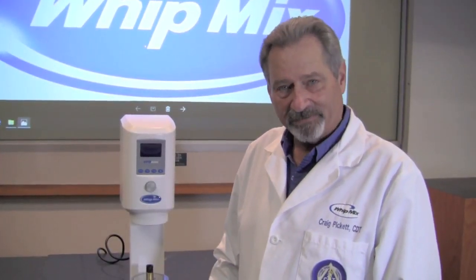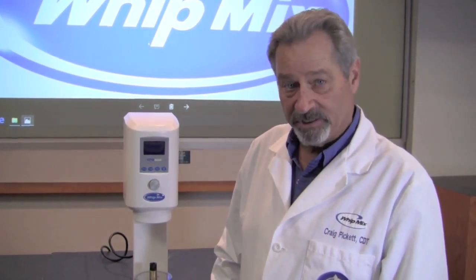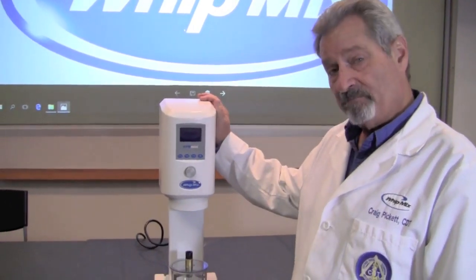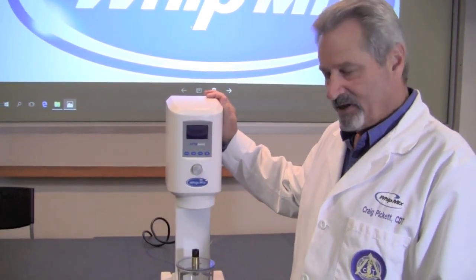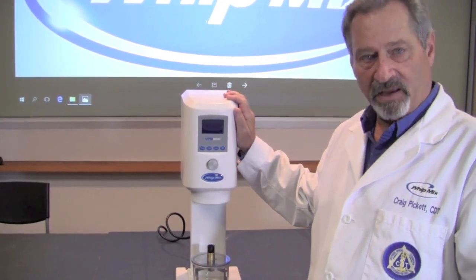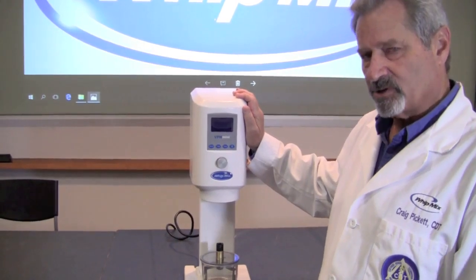Hello, my name is Craig Pickett and I'm the Technical Education Manager here at the WipMix Corporation. Today we want to talk to you a little bit about the new VPM Mini Mixer. We're going to talk about programming, maintenance, and a little bit of troubleshooting for this particular machine.